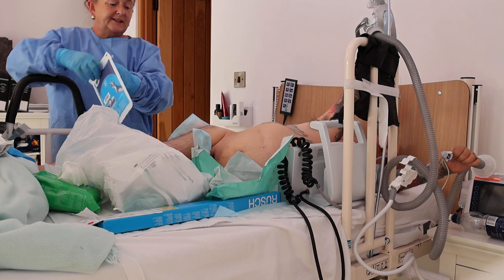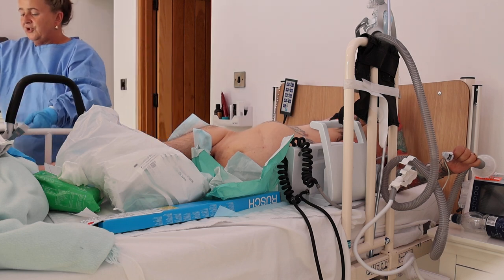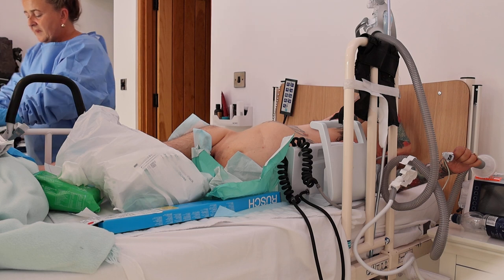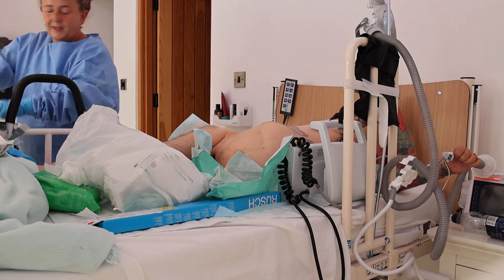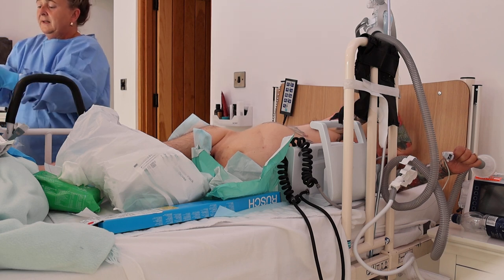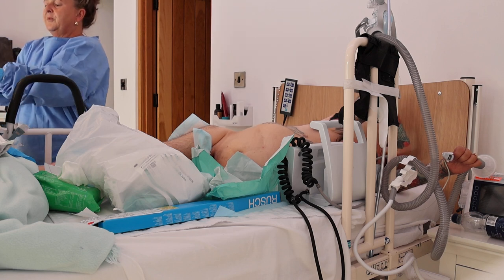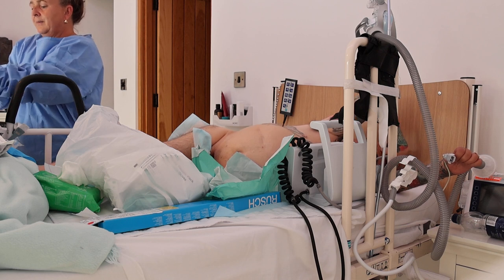So I do it like this due to the fact that, one, you get the Instillagel inside. Two, I've been doing it for 28 years, so I just recognise different signs, symptoms, whatever. So right now I'm putting three gloves on my left hand. So I'll be gloving up just in case any other urine comes at me.